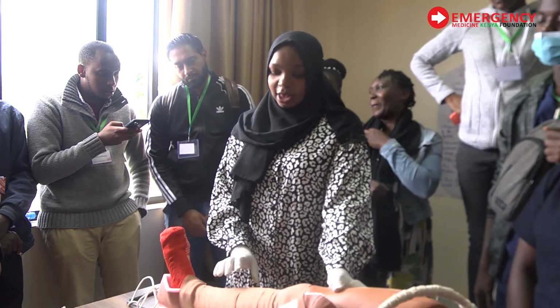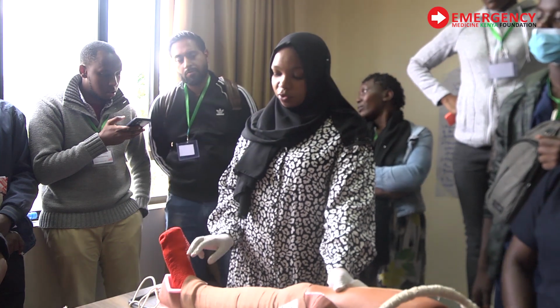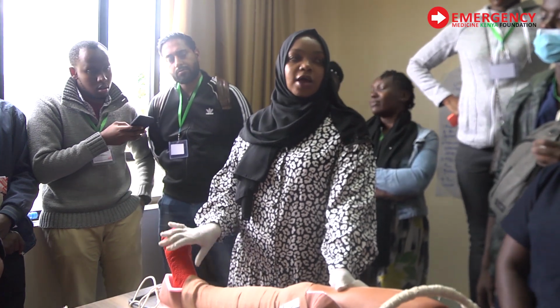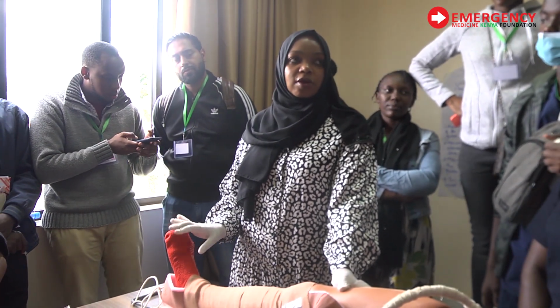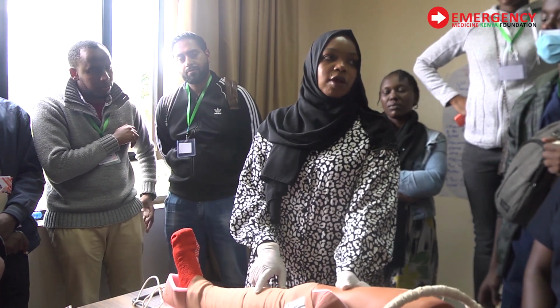So when he has this, you make sure you check your capillary refill. Make sure it's immediate. Make sure you have a good pulse. Make sure the color is good. The moment you see it changing in any of this, you know you are forming a compartment syndrome. You need to release your skin traction.